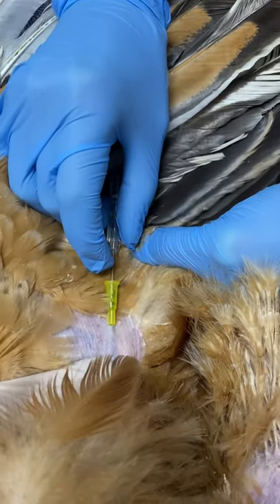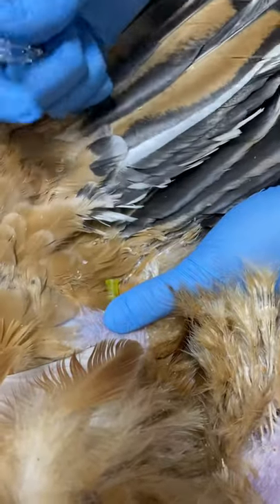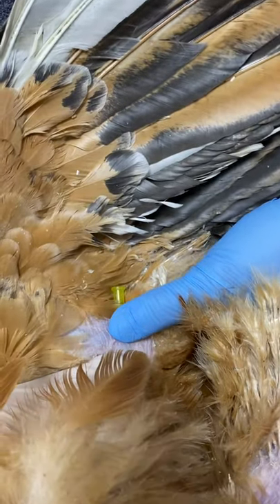We'll place that catheter and then put a little bit of pressure on there to make sure the blood doesn't come out. We'll then put a bung on that catheter and suture it in place.